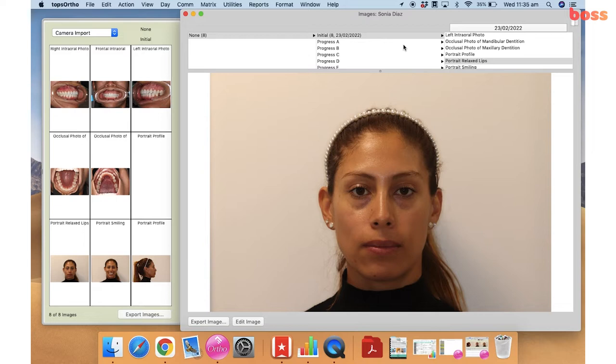What we're using here is our software which is TOPS. I've already uploaded all the photos into the corresponding titles, so we've got our intraoral photographs, our occlusal photographs, and then we have our three extraoral shots as well. You can also edit these photos on PowerPoint, Keynote, or externally on Adobe or JPEG and then import them into your PowerPoint documents.